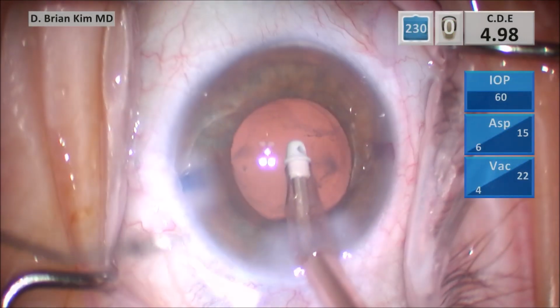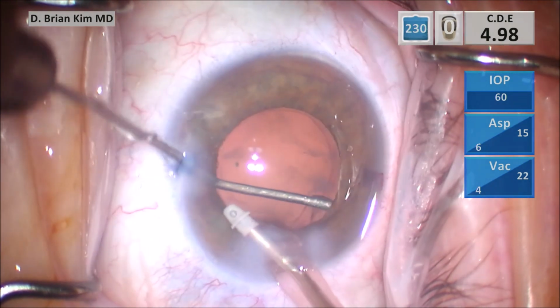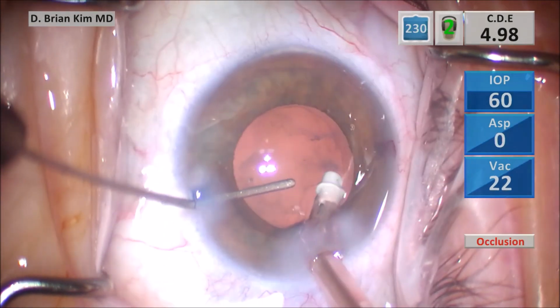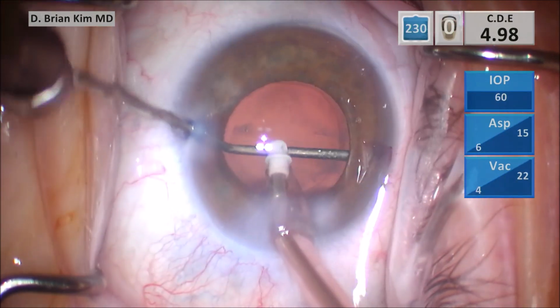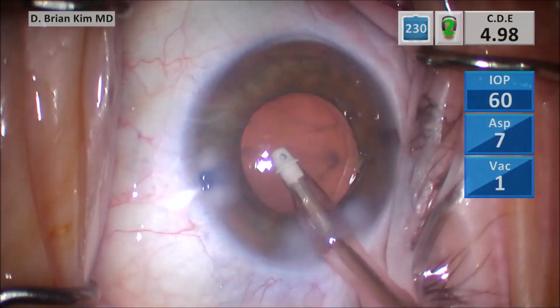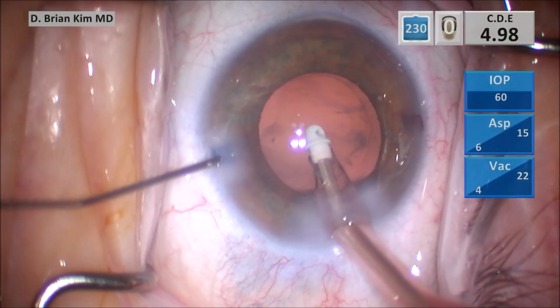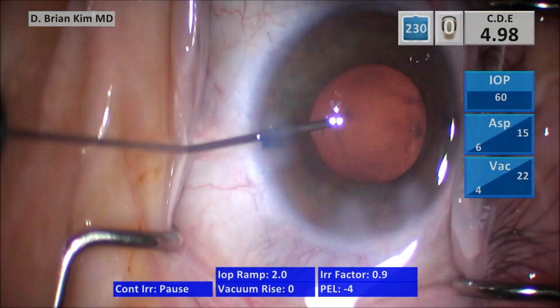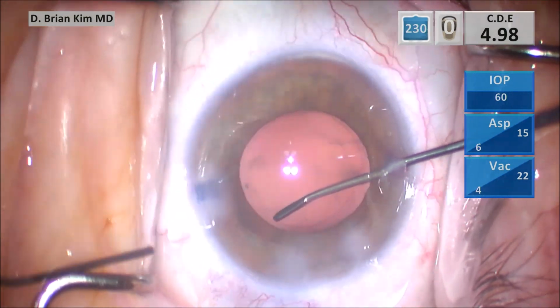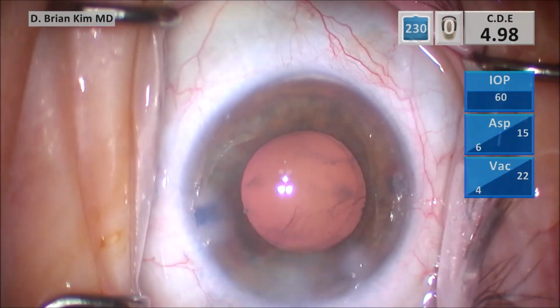So now I'm going to go in with the BSS cannula and try to pulse in the sub-incisional capsular fornix, and you can see it does actually liberate a little bit of that cortical material that's there. So I'm injecting some cohesive viscoelastic to fill the capsular bag. I'm going to polish with the capsule sweep on the left side and then on the right side.